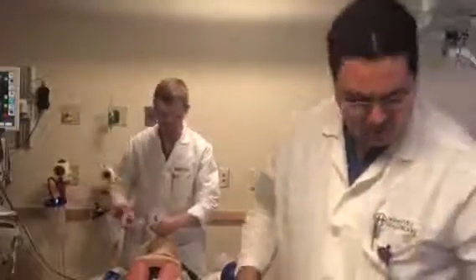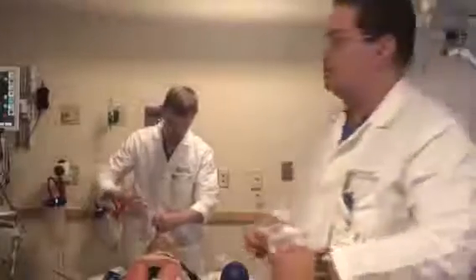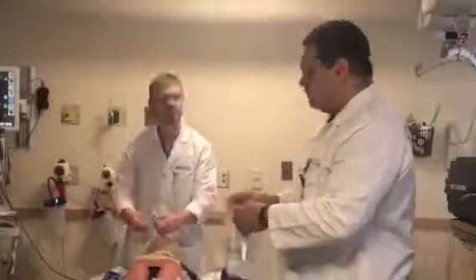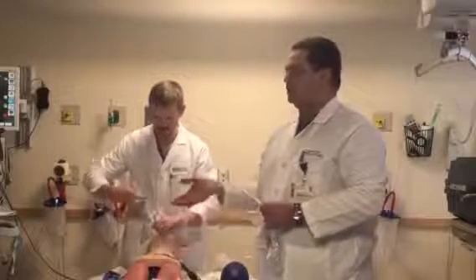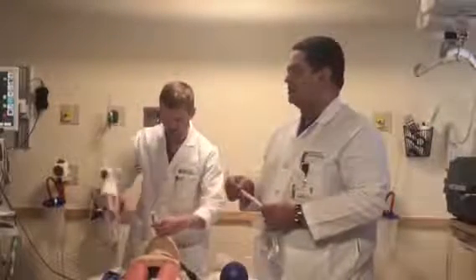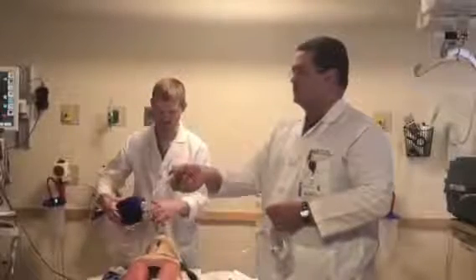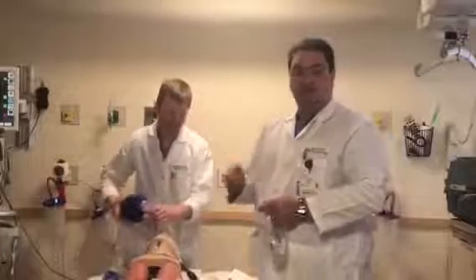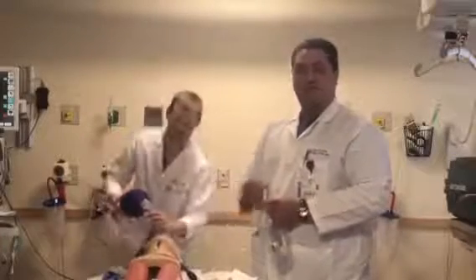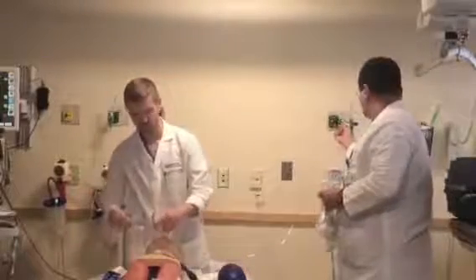Did you guys hear about something called the jet ventilator? Yes, jet ventilator. If you can't get a cric, which I don't know why you wouldn't be able to, but let's say there's a disaster and you can only get a 14 gauge or even 18 gauge angiocath to put here. You can't ventilate effectively from something like this, right? So you can hook it up to the wall directly.